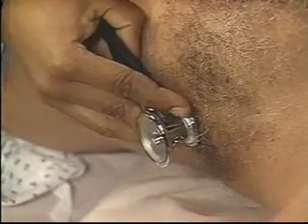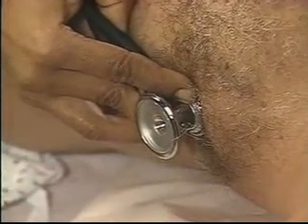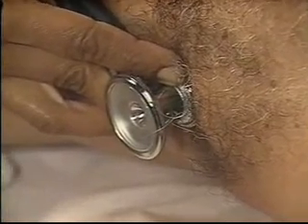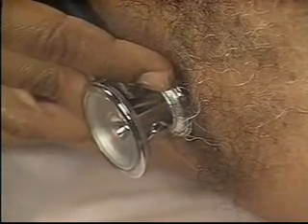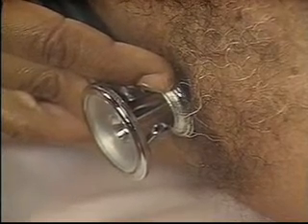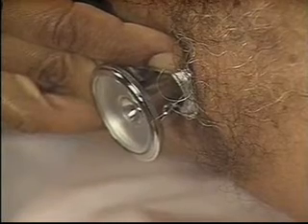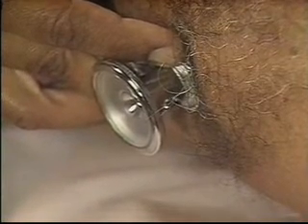Notice how the third heart sound disappears when the bell is placed more firmly on the chest wall. Listen again with light pressure, then with firm pressure, and once again with light pressure.